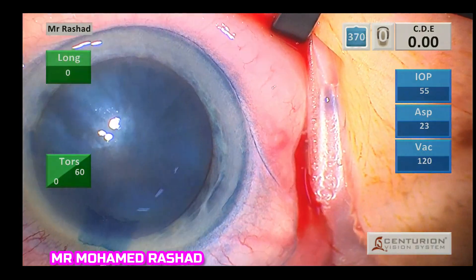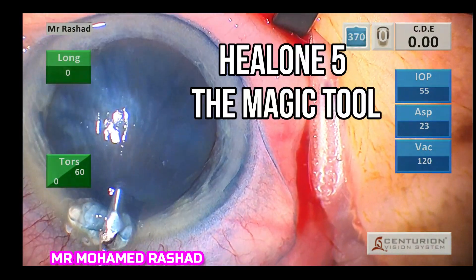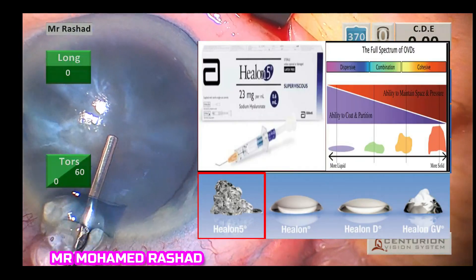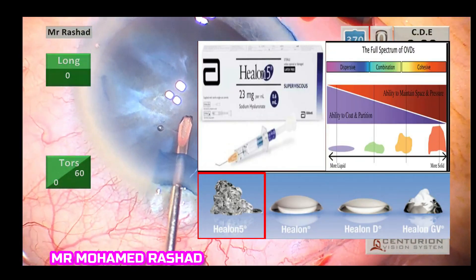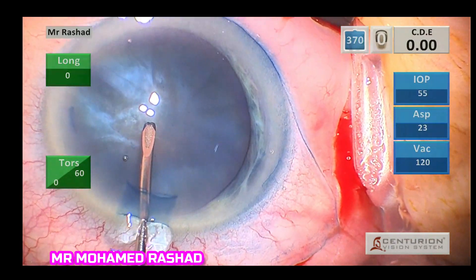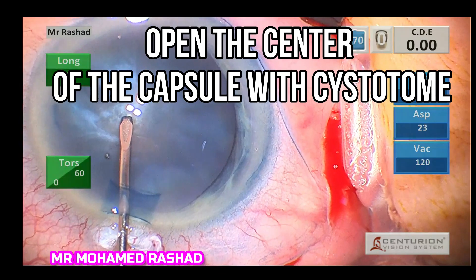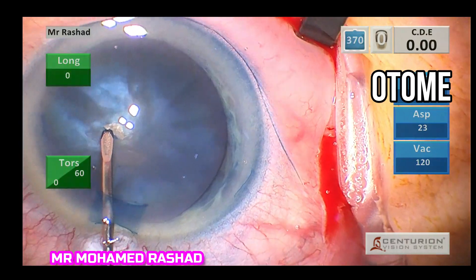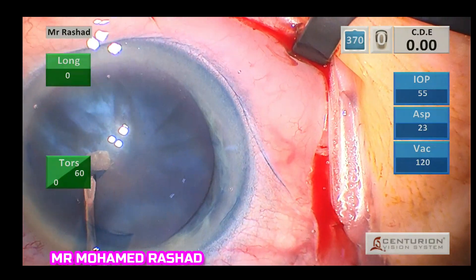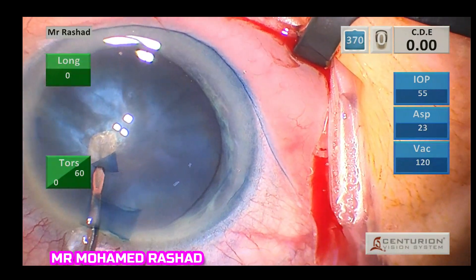What I am describing in this video is the most important step that can help you: injecting the Healon 5, which is the magic tool and is very viscous.